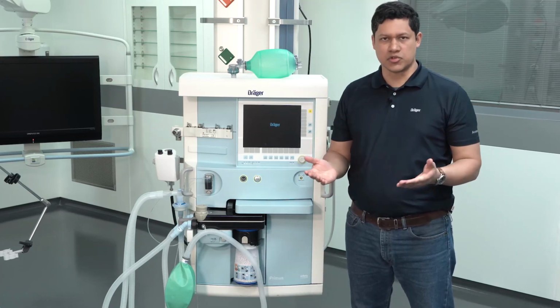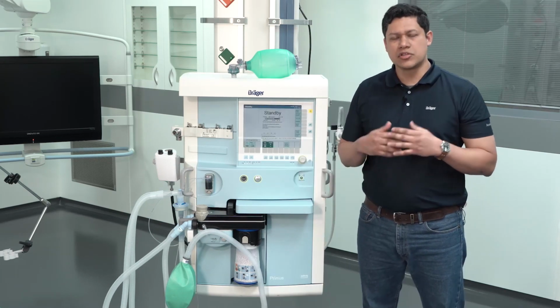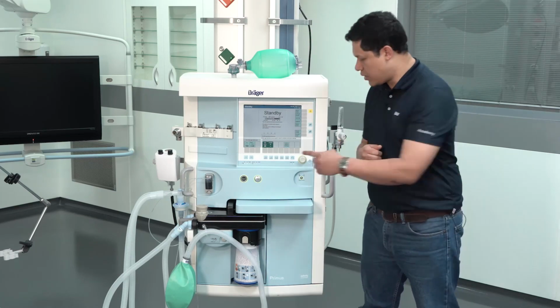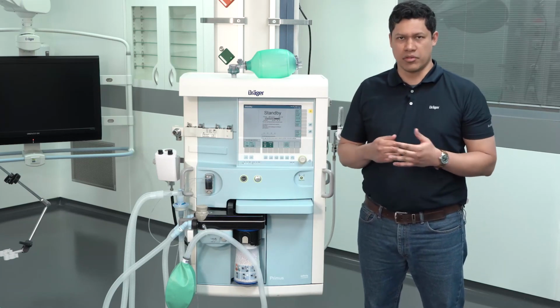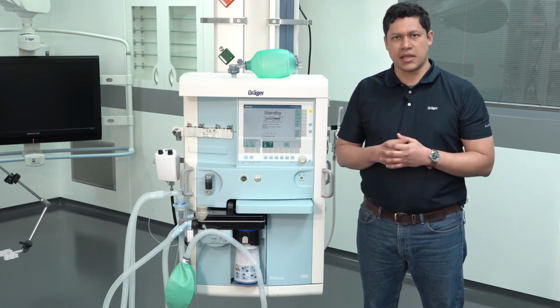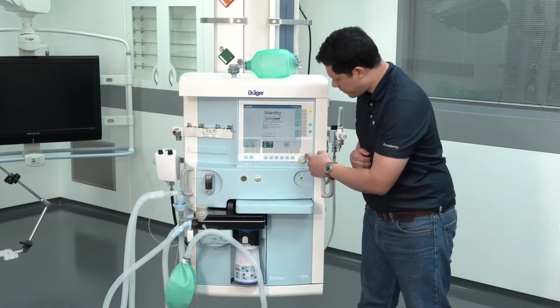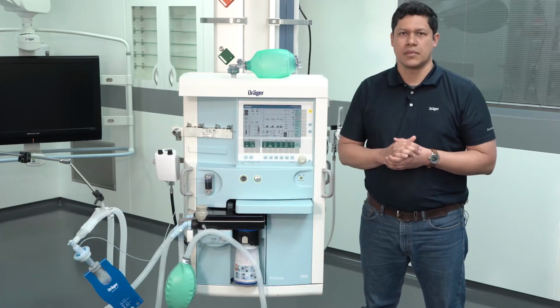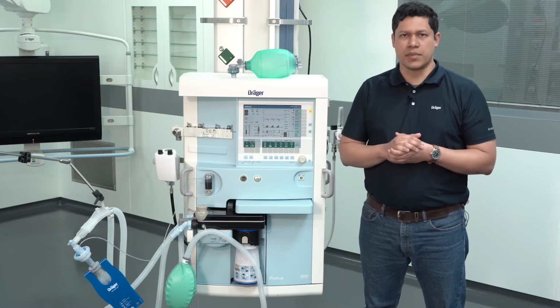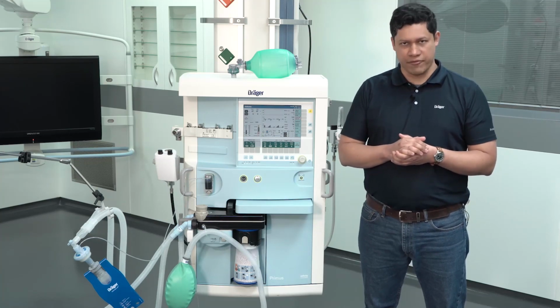Use the manual spontaneous mode only after you have been instructed on its use. It is not recommended to use the external fresh gas outlet, nor the pause mode, which is available on our Atlan and Perseus A500 devices, nor the monitoring mode. Keep in mind that in volume control ventilation modes, leakages are not automatically compensated. Therefore, pressure control ventilation modes are preferred.